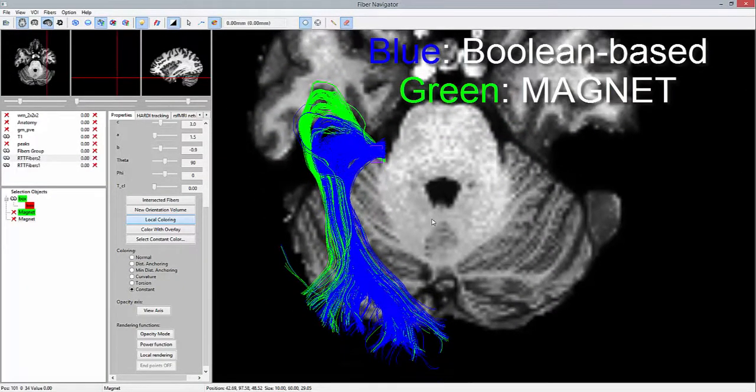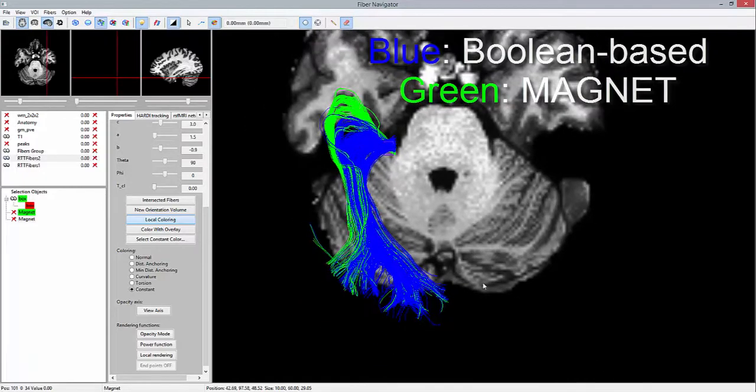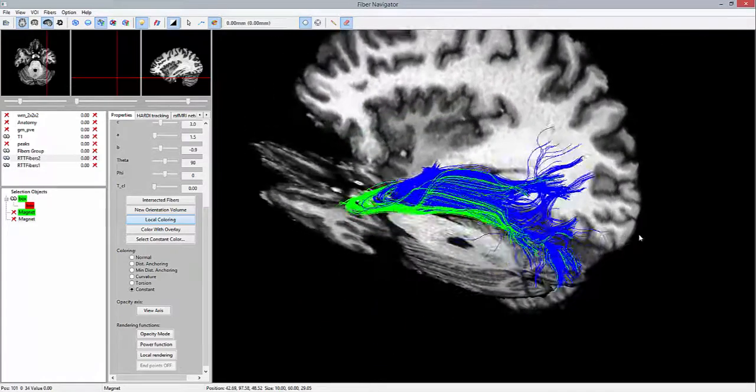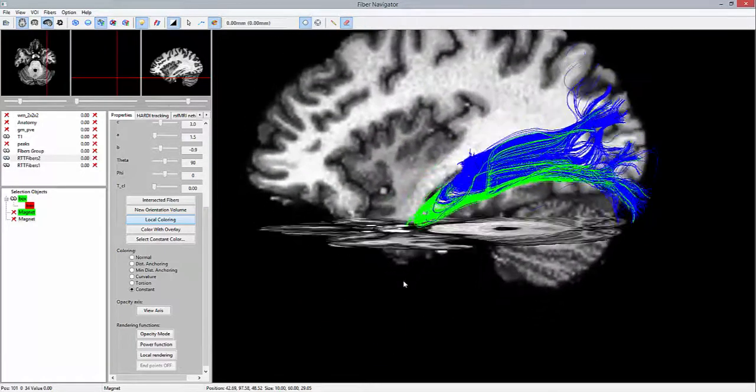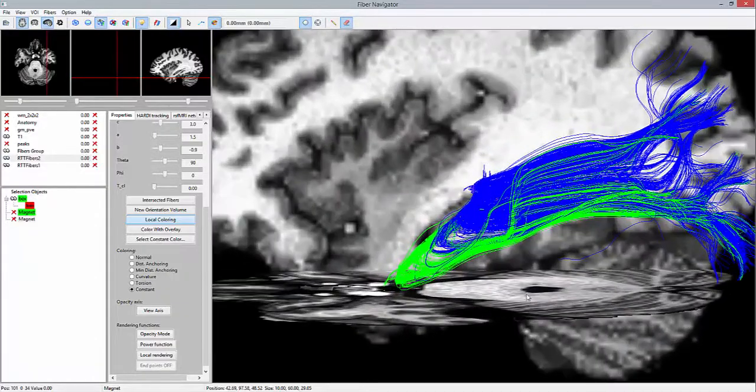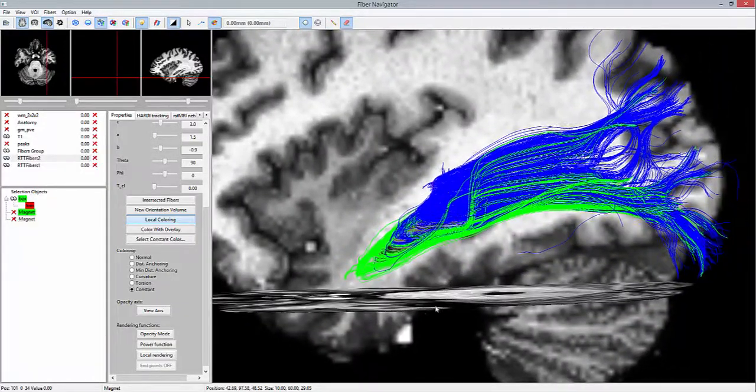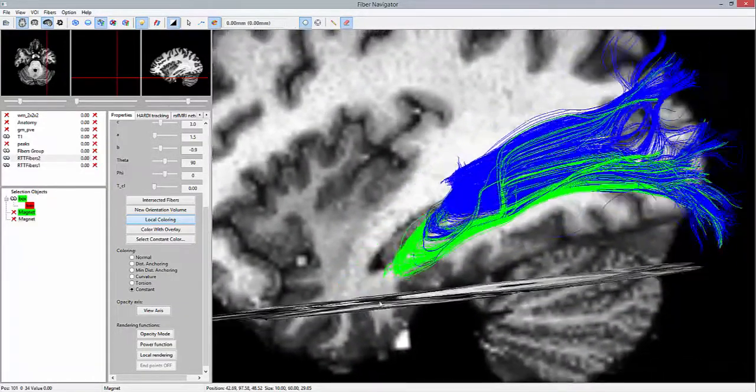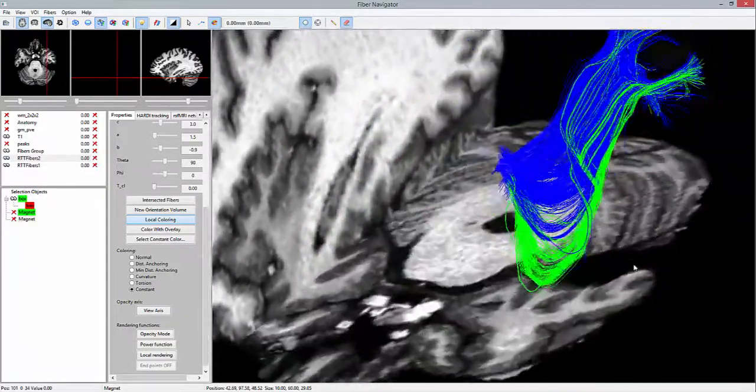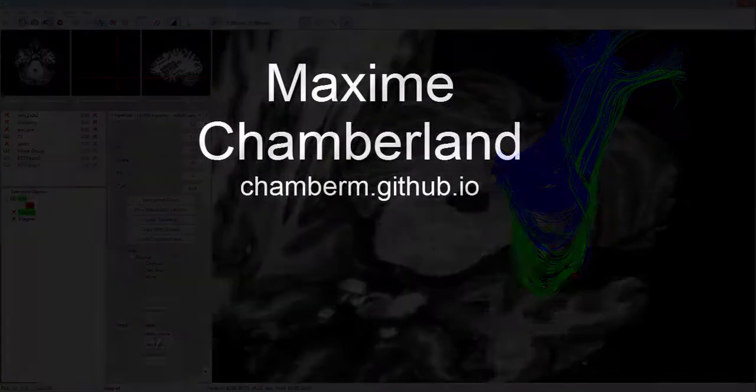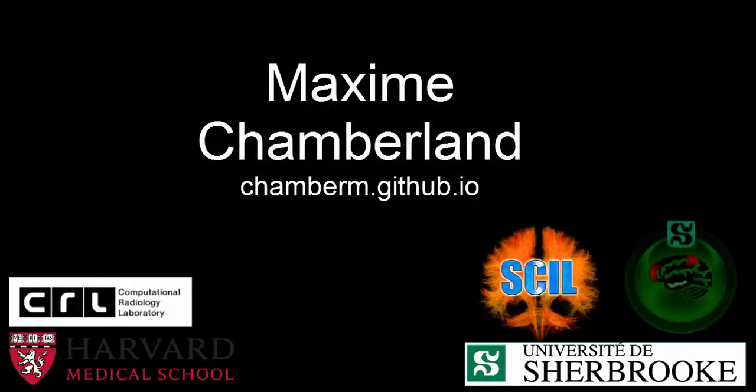This final view shows the added extension of magnetic tractography, represented by the green color. We can appreciate a deeper prolongation of the tip of Mayer's loop from this sagittal view.